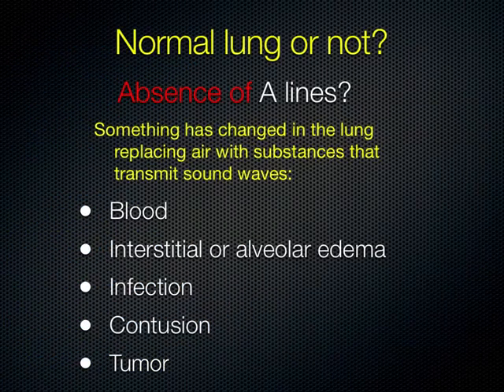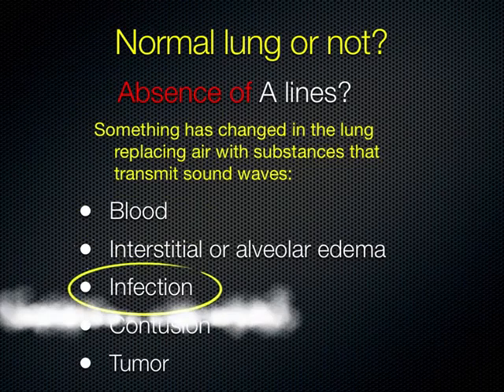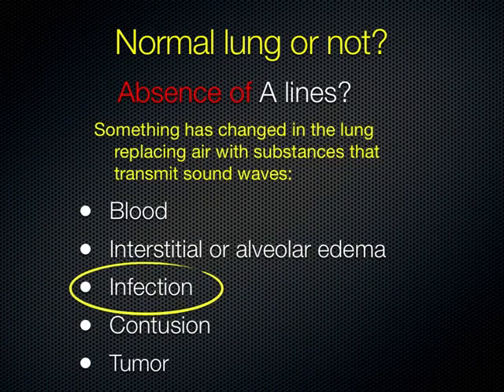But what we're talking about right now is infection or pneumonia. And so it's when you lose those A lines, when there's absence of A lines, that there's something that's changed in the lung that replaces the air with some kind of substance, whether it's fluid or infection, that can transmit sound waves.